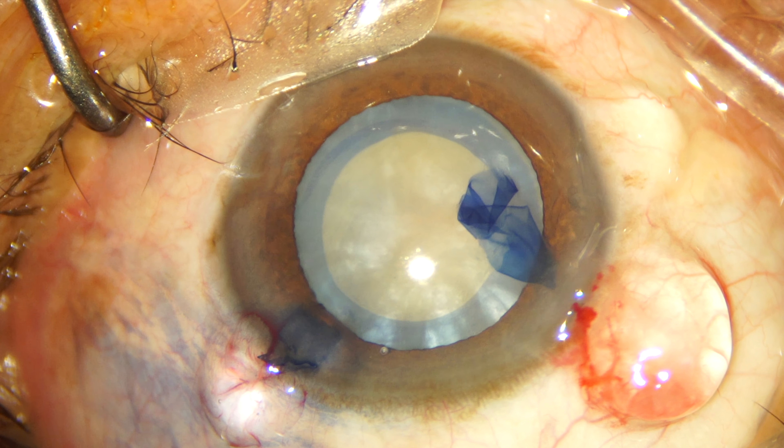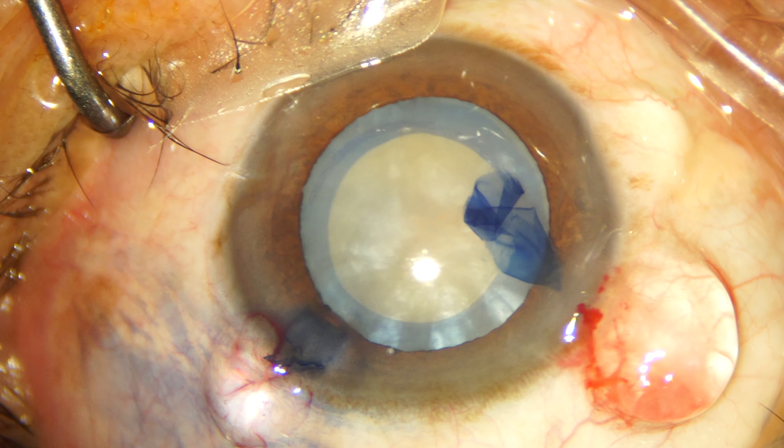We have managed to complete an adequate capsulorrhexis of about 5 to 5.5 mm and we are going ahead with the direct chop technique for the nuclear fractures.